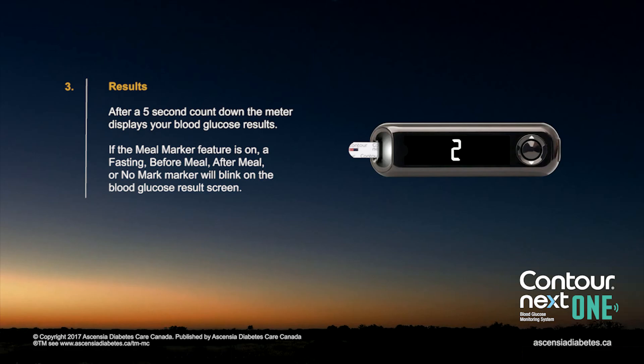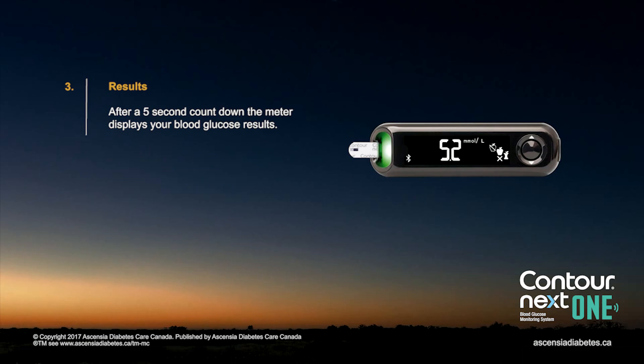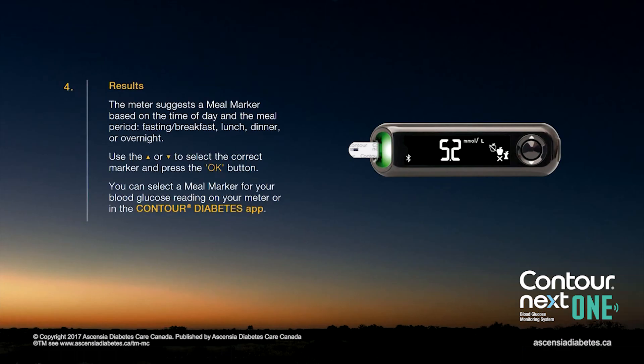If the meal marker feature is on, the marker options will blink on the screen. The meter suggests a meal marker based on the time of day and the meal period: fasting/breakfast, lunch, dinner, or overnight. Use the up or down arrow to select the correct marker and press OK. You can select a meal marker for your blood glucose reading either on your meter or in the Contour Diabetes app.